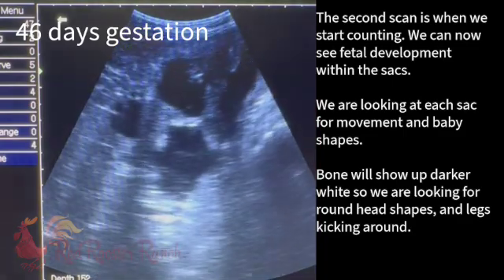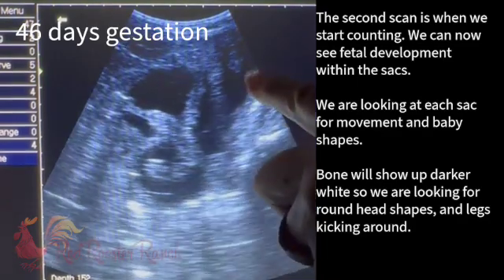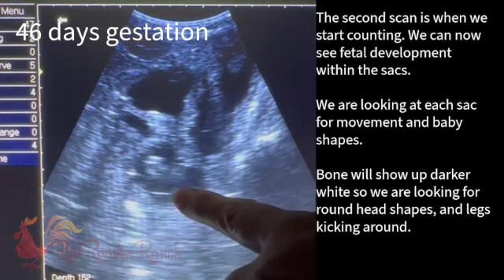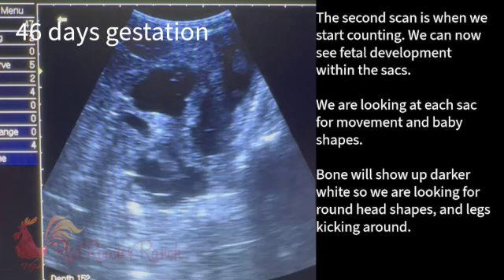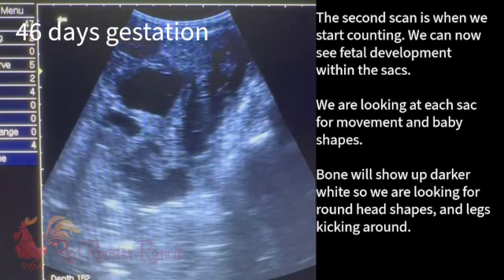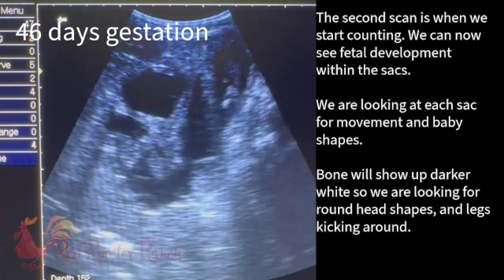We're going to focus on this bottom one for a minute. Seeing movement up there. This is why we record it — because if I was just totally focused there, there's movement, and if I only focused there, I would have missed it. So I like to be able to go back and watch the entire video focusing on each of the sacks.